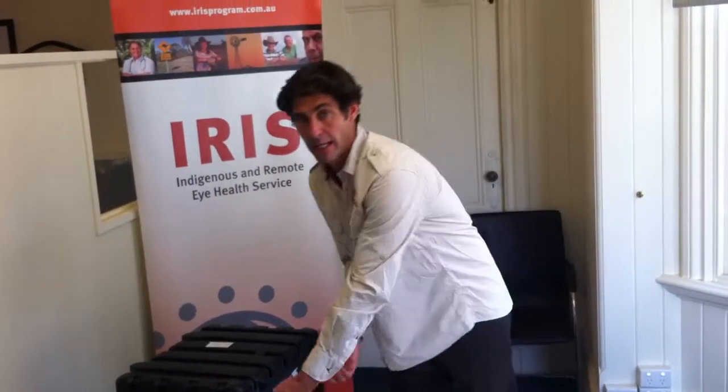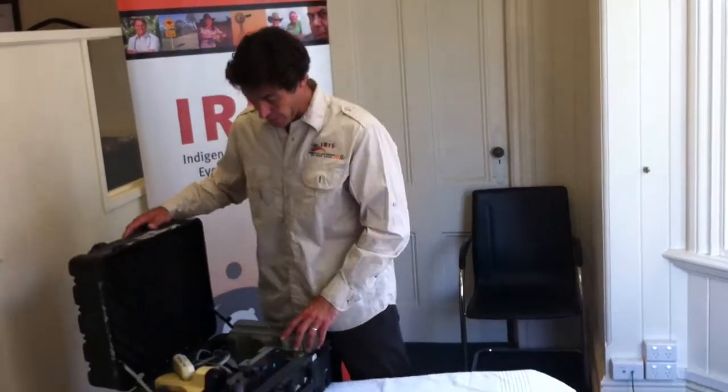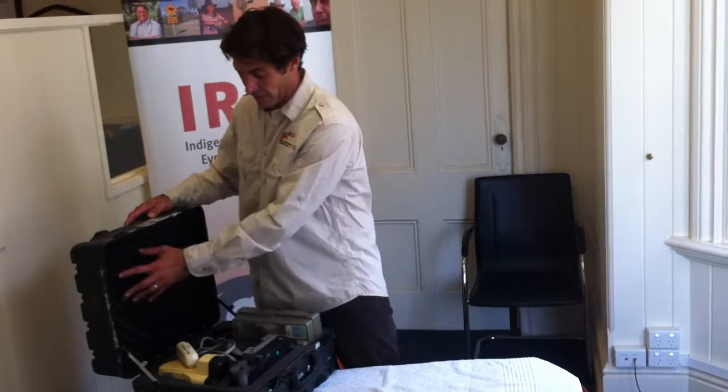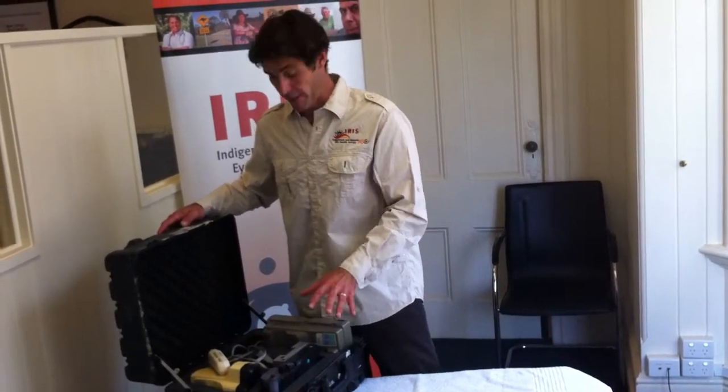The other part of the kit we always find very useful is having an autorefractor keratometer. It's just been renovated — the insides of the box have been redone. It is an older model, but I still use one every day.